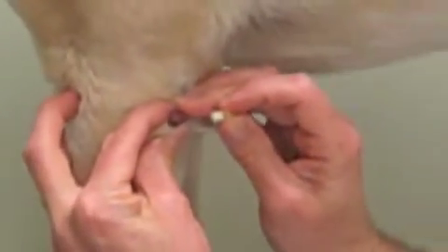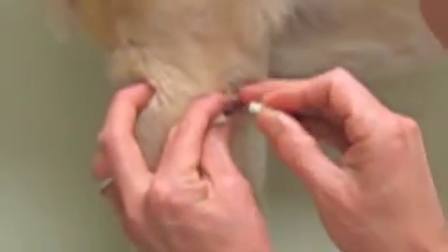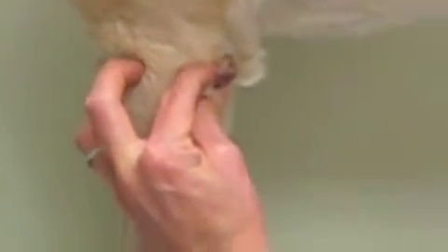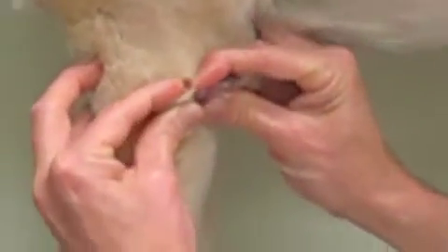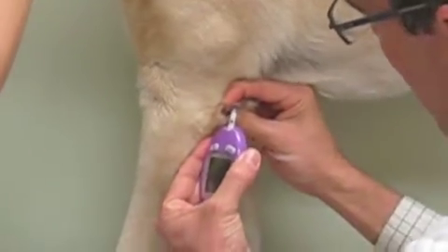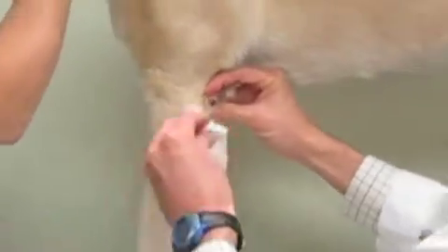I tend to usually pinch for maybe 20 or 30 seconds, again just to engorge the area. I then give a little poke, and I make sure it's in there for a second with a little twist. Then I just hold it for a moment, and if you can see in there you'll see the blood forming — a nice little area. I take my instrument and go to the side and just let it wick right in. That took its sample.